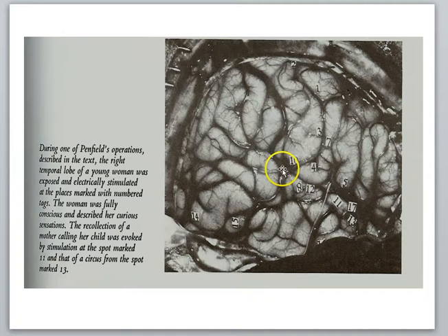The key thing that the fMRI technique takes advantage of is that when a particular part of the brain becomes activated, it recruits an increased blood flow to that localized region. So let's pretend that this person is not undergoing surgery, but instead they're in the fMRI machine, right? And let's say whatever task they're doing, it is activating region number 3 here.